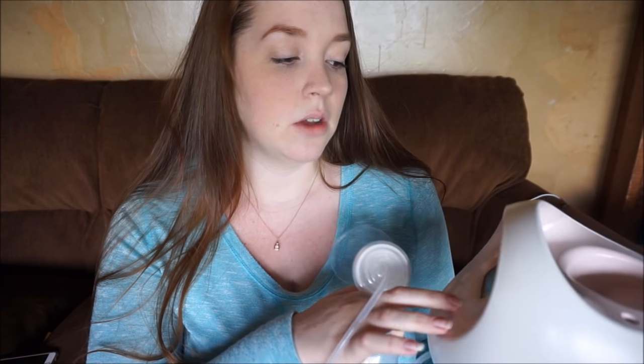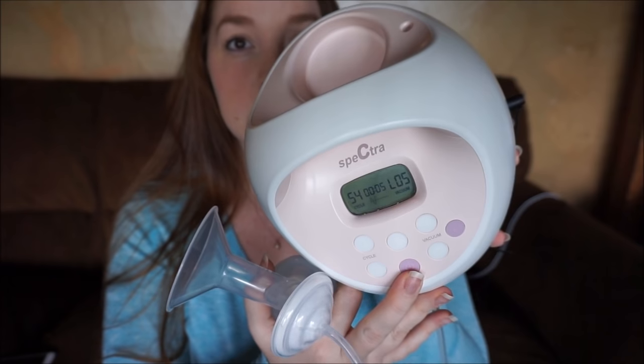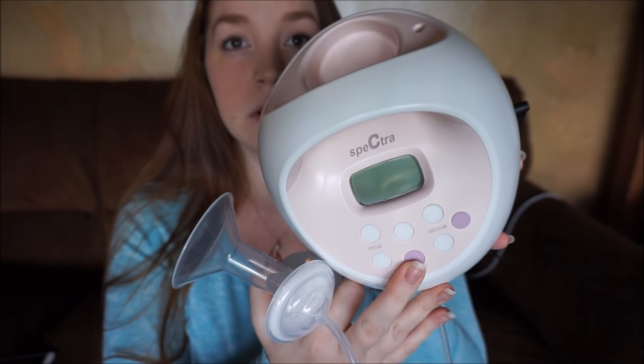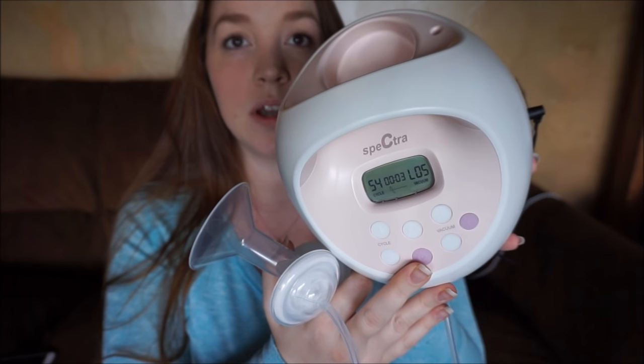At night, I have no problem — it doesn't wake my baby Remy up, and she's actually pretty sensitive to sound. One thing I want to show you: the pump has a memory setting. If I turn it off and turn it back on, it goes right back to what it had been on. So it does have memory, which is a good and bad thing — I'll get to that later.